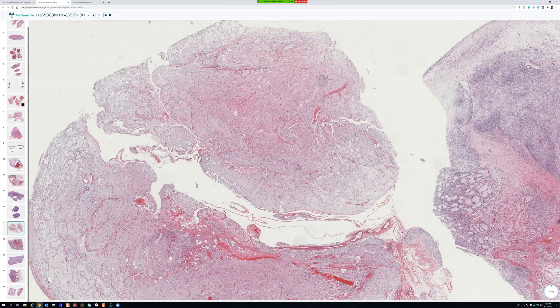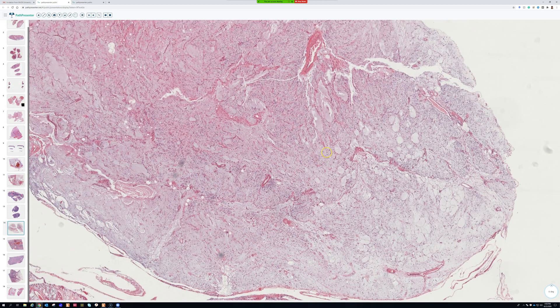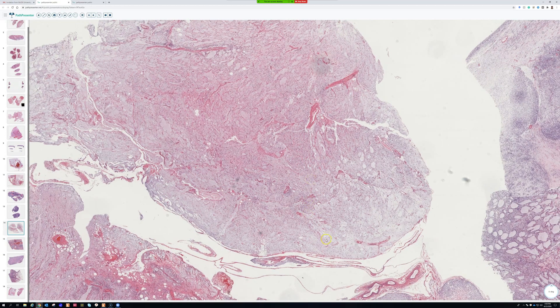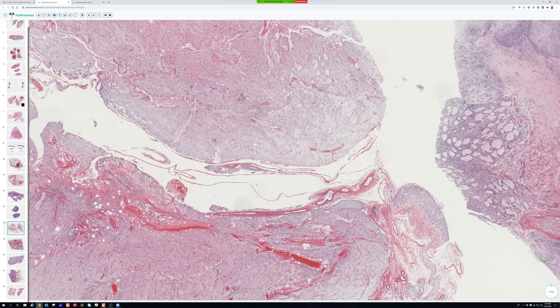If you see something in a child that looks like myxoid liposarcoma, the first thing you should think of is lipoblastoma, which can have very close morphological overlap and look very similar. The difference is totally benign versus malignant — a huge difference for the child — and it's easy to solve with molecular testing (FISH). I've had times where molecular testing has been very helpful in those cases.